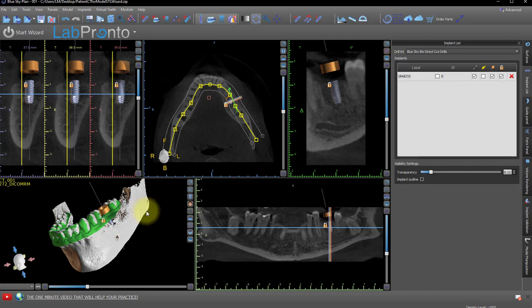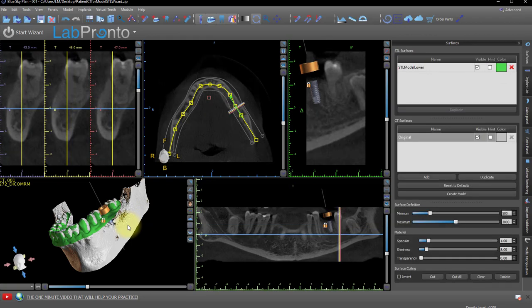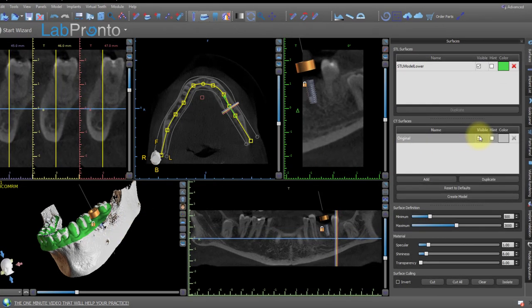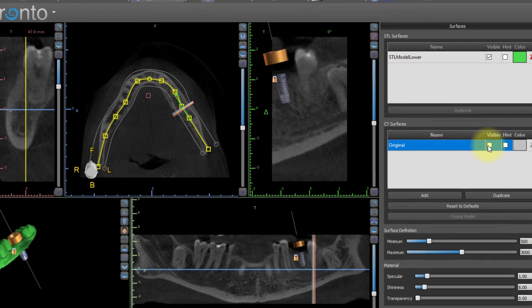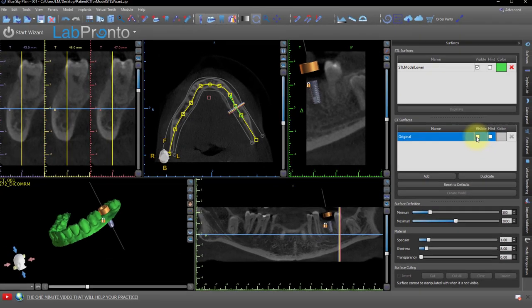Open up the Surfaces panel. You can do that as a shortcut by double-clicking on the bone in the 3D panel. What we can do is just hide the CT scan in the 3D by unchecking the CT Surface Visibility checkbox in the Surfaces panel.